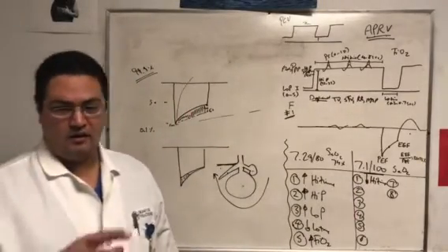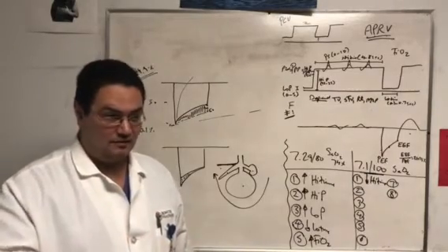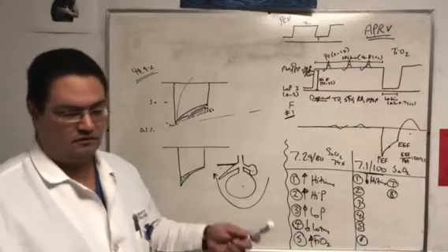I'm reminding you again, we're talking about classic APRV. We're not talking about the BILEVEL that we use every day. Okay? There's a big distinction, and I think that's the key to understand this stuff.